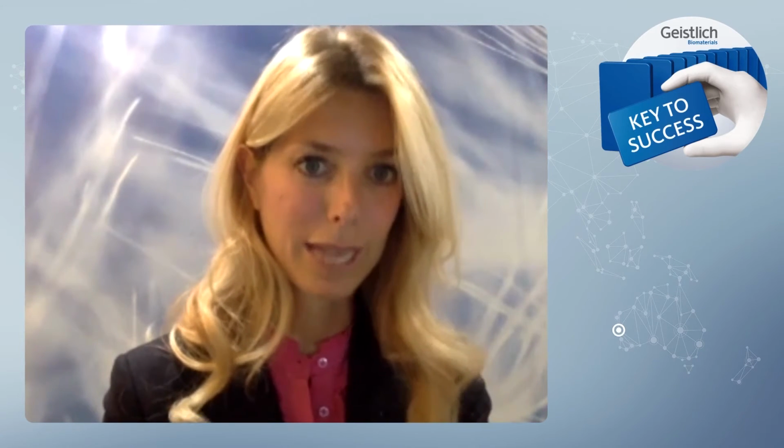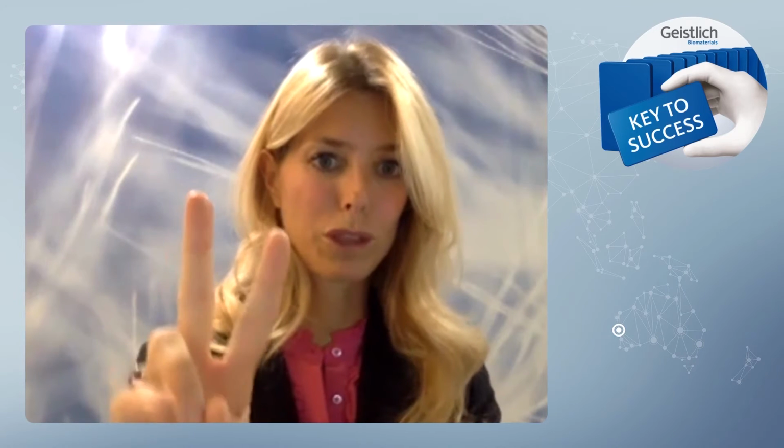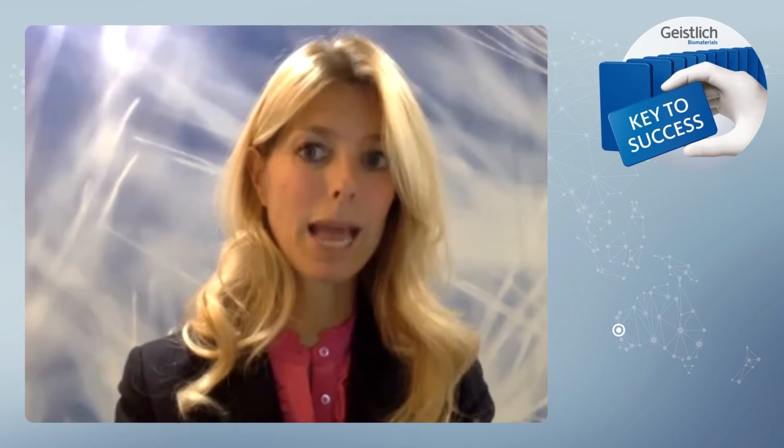I would say that 90% of the posterior cases that I treat, lower mandible, require a free gingival graft at the time of healing abutment connection. So we have done all the surgeries, we have augmented, we have removed the membrane, we have positioned the implants, we have left them for 4 months in the newly regenerated bone, and at that moment, it's the time for 2 things. In the posterior, a free gingival graft to re-establish the depth, and that has beautiful results. And for the long-term prosthetic margins and the maintenance of the patient in terms of brushing, this is very viable.